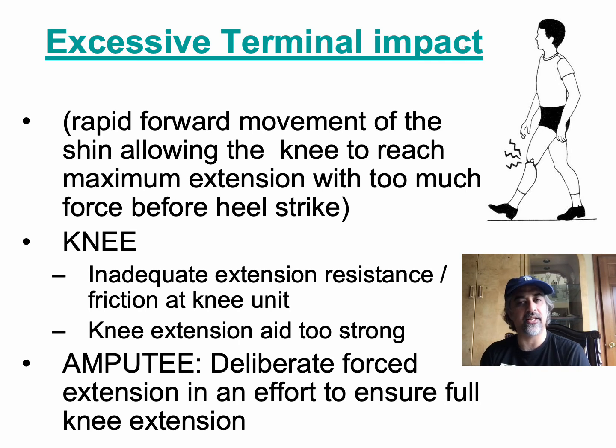Usually this is the amputee trying to compensate for a feeling that they can't get enough stability out of the knee. So just make sure that the knee itself is, the friction is, the mechanical friction or the hydraulic friction is dialed in properly.